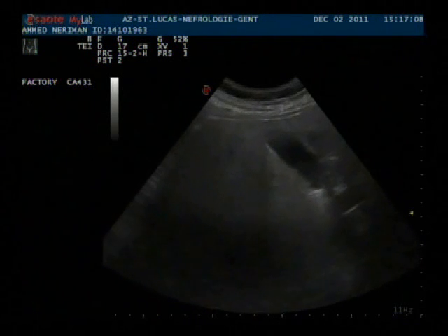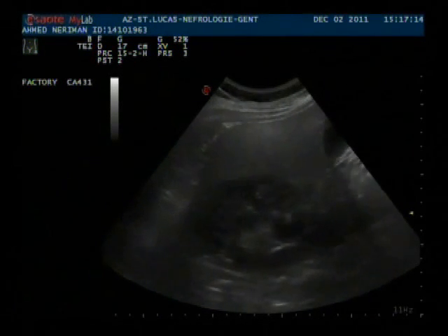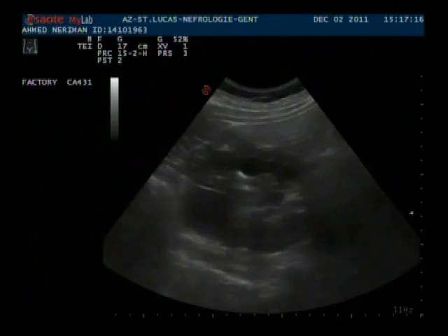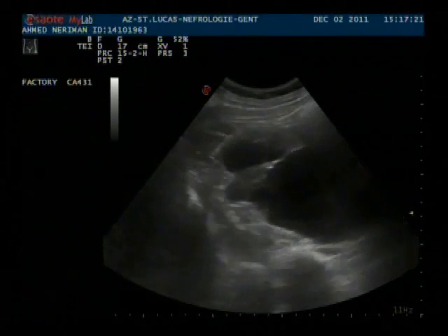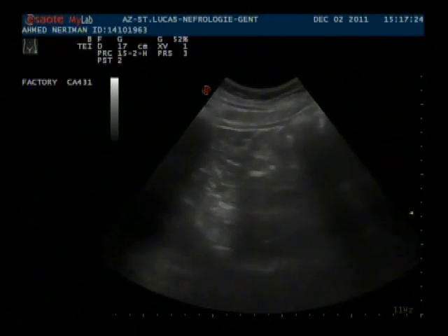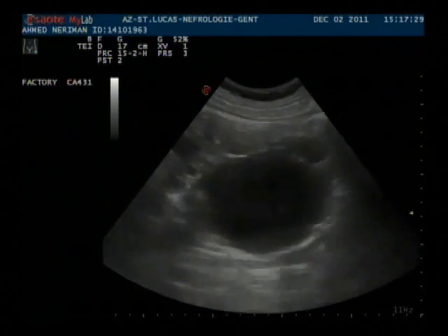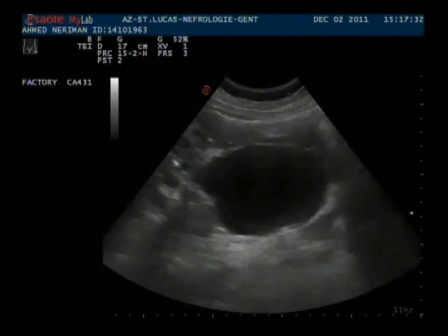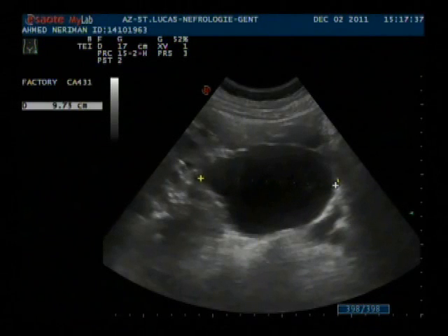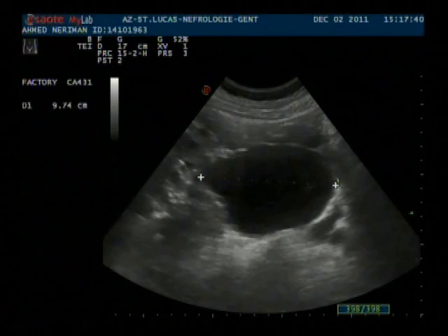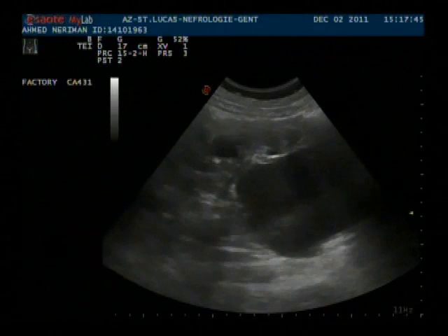We do an ultrasound of the abdomen, and we see a pretty hyperechoic echogenic liver. Straightaway in a transverse view through the kidney, we see that the right kidney is enlarged and has multiple cysts. We scan in a transverse way and see a large cyst in the lower pole of the right kidney with a diameter of nearly 10 cm. This was the area where she was quite tender on clinical examination.